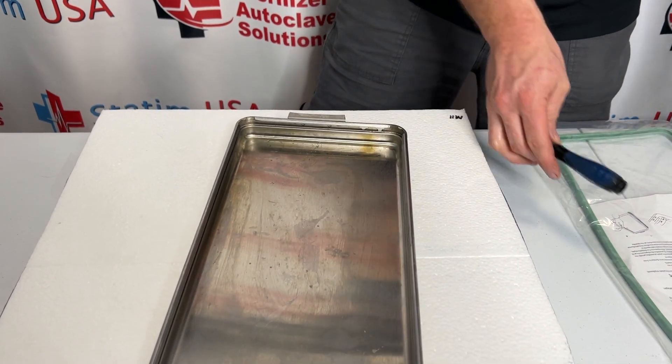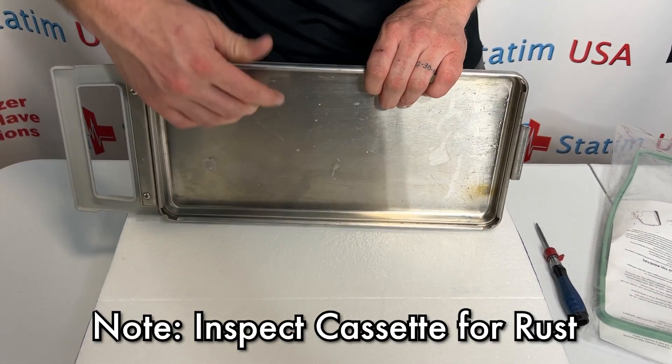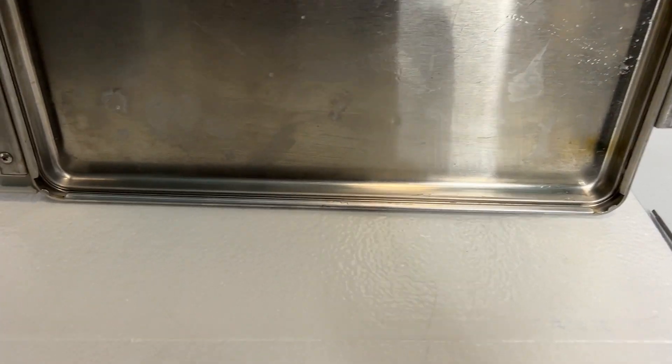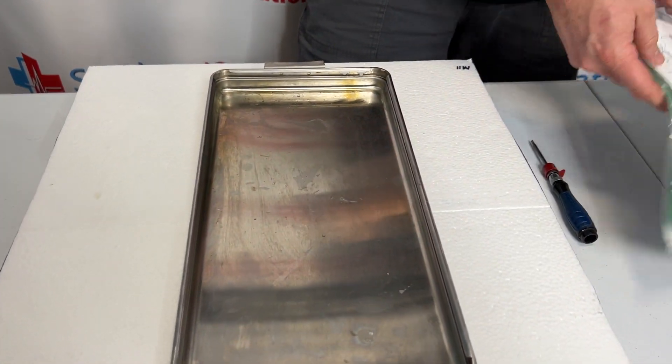We are going to set that off to the side. We do want to inspect and make sure there is no rust or anything built up on the surface where that cassette seal is going to go.